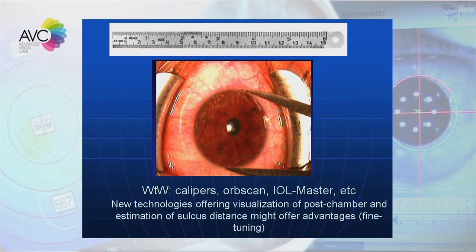ACD may alter the post-op expected refraction, yes, that's clear, and the ACD may alter the suggested ICL length to be implanted. This is an important point. So we do not look only at the refraction and the white-to-white lengths. We have also adjusted the nomogram for the lens selection based on the size of the eye, which is determined through the ACD measurement. Now this is one way you can measure the white-to-white, with the caliper. Some people do it with the Orbscan. Some people do it with the IOL Master. Various technologies are out there to determine the lens length.